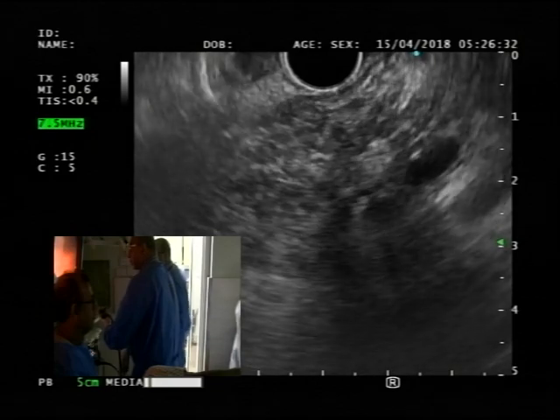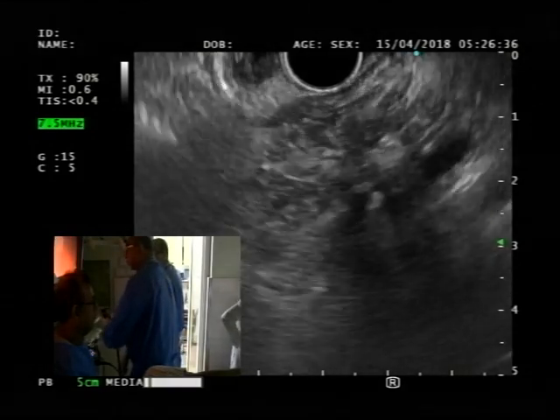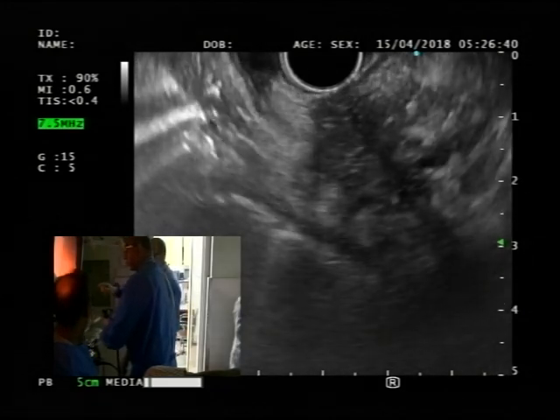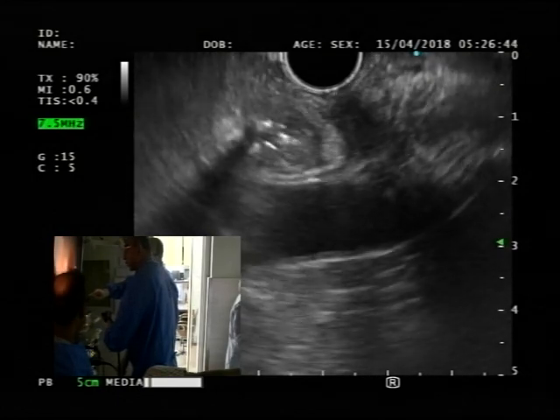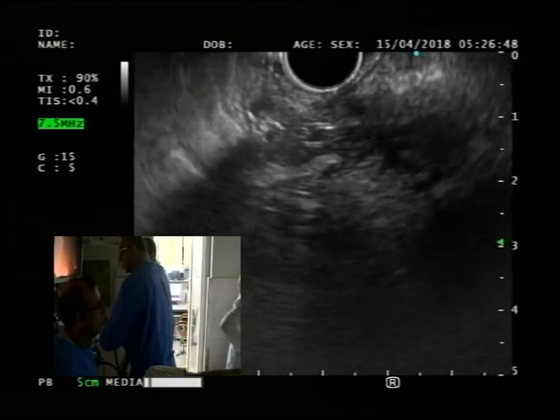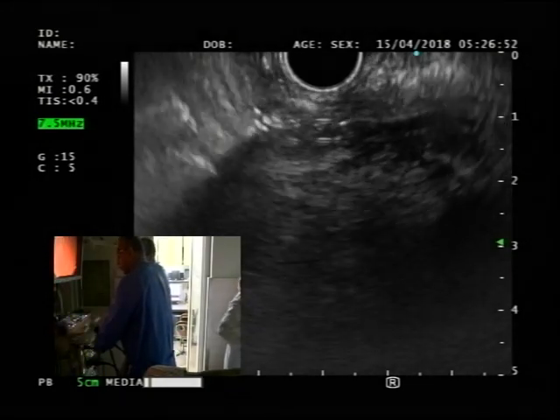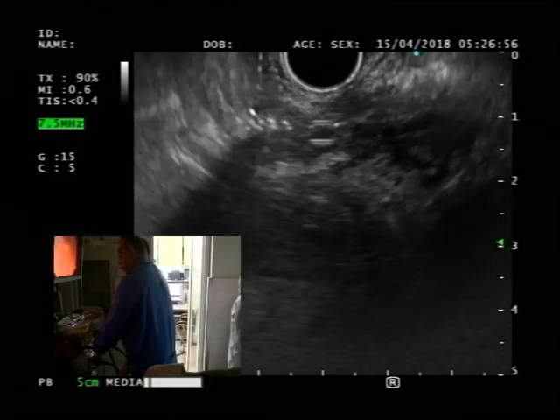That's it. And then, there you go. Now keep going counter, it's okay. Counter will take you towards the bile duct. So keep going counter, keep going, there. That's the aorta behind you. Now go clockwise and go the other way. There you go. And as you go clockwise, you should see the pancreatic duct in the bottom.